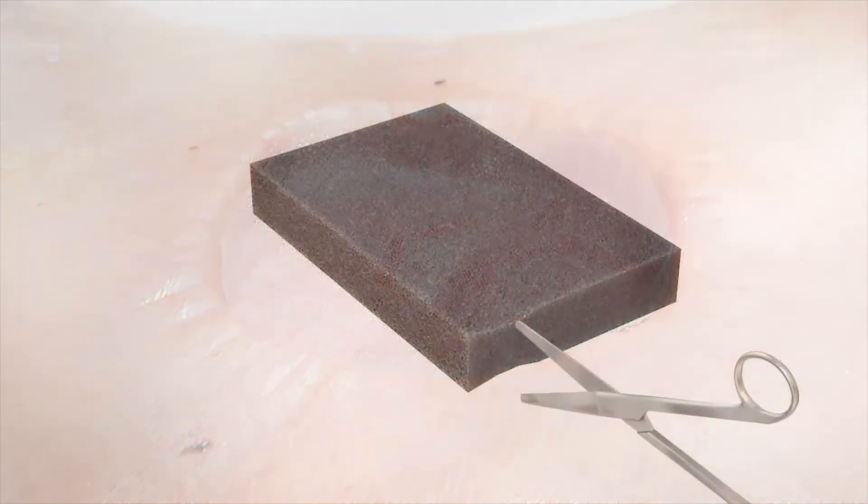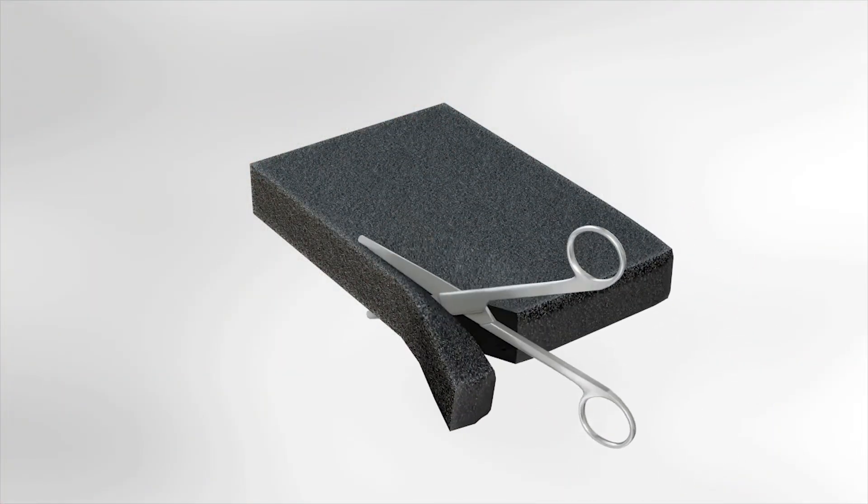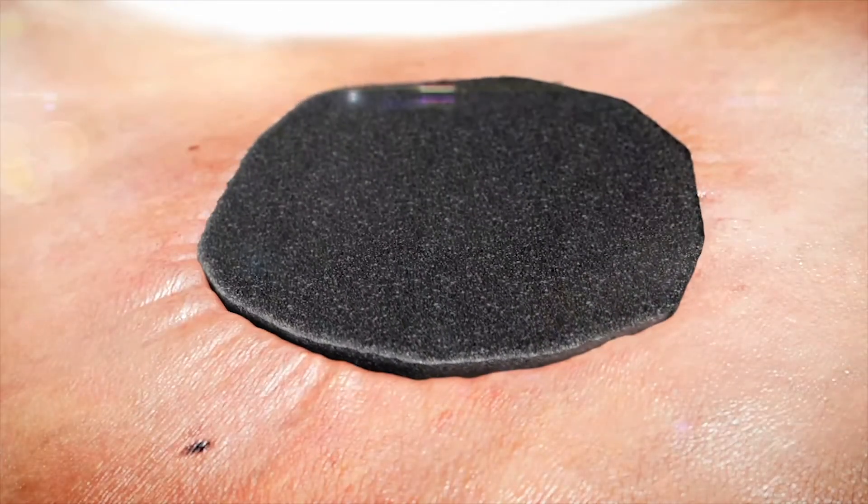Cut the foam dressing to fit the size and shape of the wound. Place the cut foam into the wound. Avoid overpacking. The foam should completely fill the wound cavity. It may be necessary to stack pieces of foam in deep wounds.